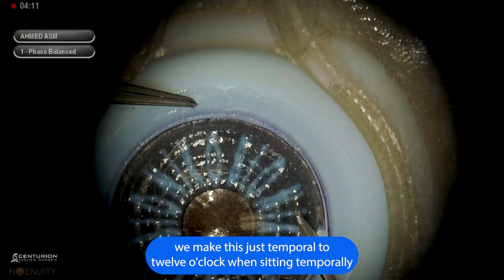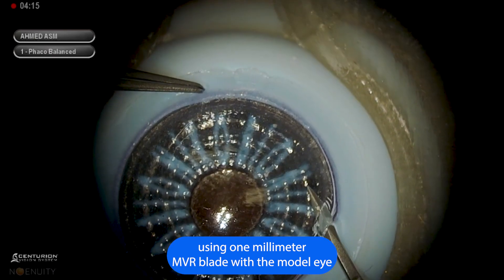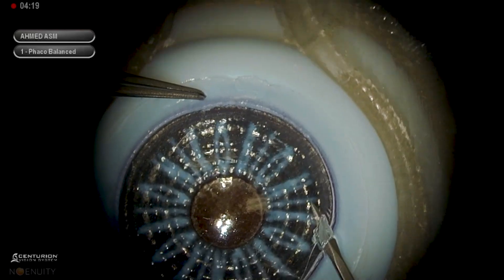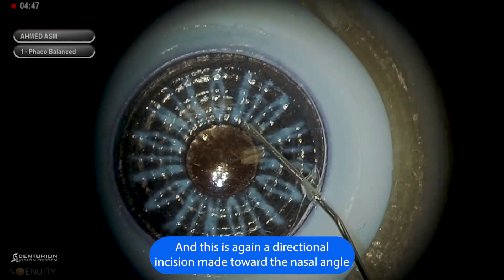We make this just temporal to 12 o'clock when sitting temporally using a one millimeter MVR blade with the model eye. We make the incision a bit larger than we normally would in the human eye just to facilitate entrance, and this is again a directional incision made toward the nasal angle.